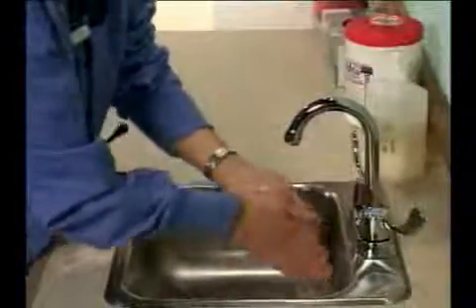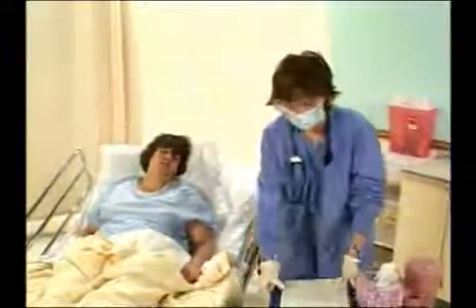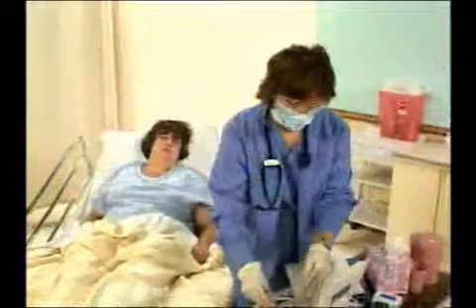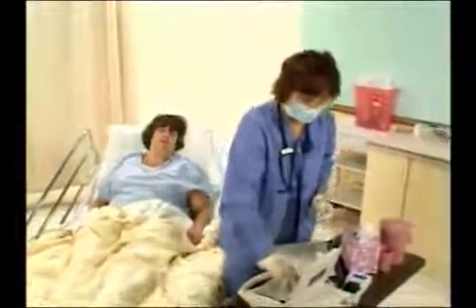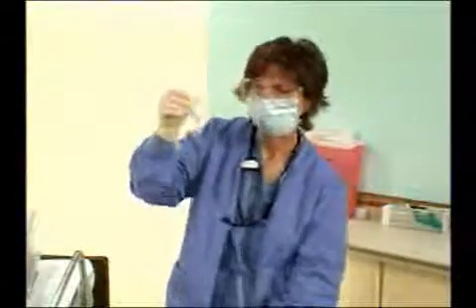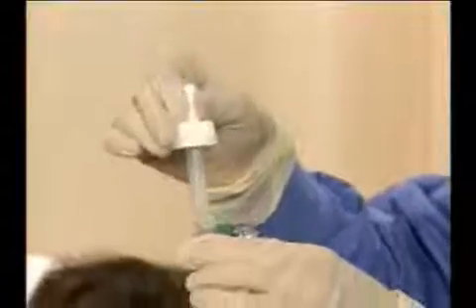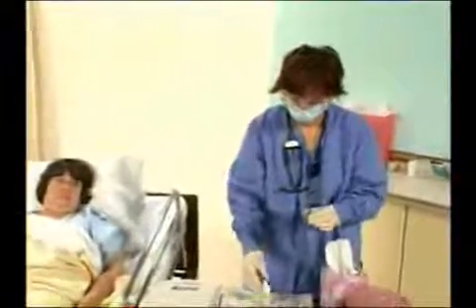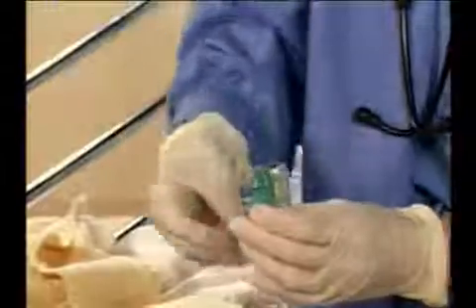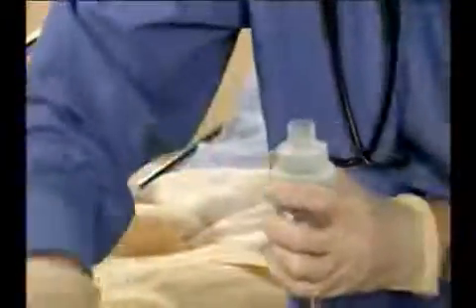Wash your hands before setting up the nebulizer. Verify the medication the 3rd time and then prepare it for administration. Attach the tubing to the bottom of the nebulizer cup and attach the other end to the air compressor or wall air. Look at the medication at eye level if using a dropper to dispense the solution into the nebulizer. Determine the correct amount of medicine and pour the entire amount into the nebulizer cup carefully so you avoid touching the drug. To prevent spillage, cover the cup with the cap and fasten it.